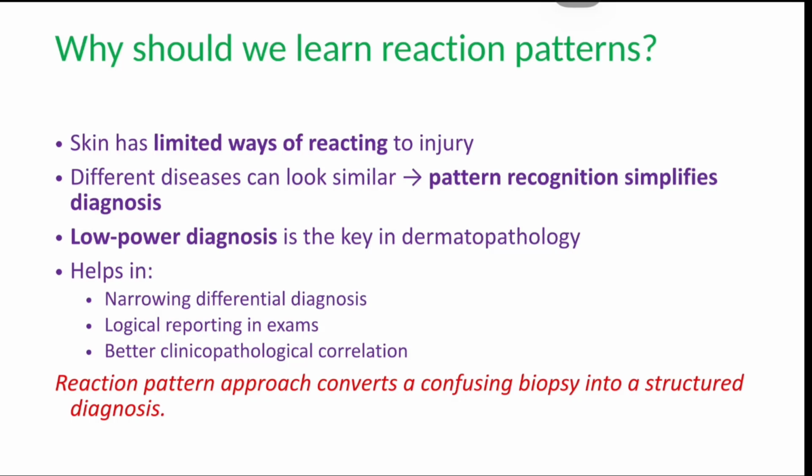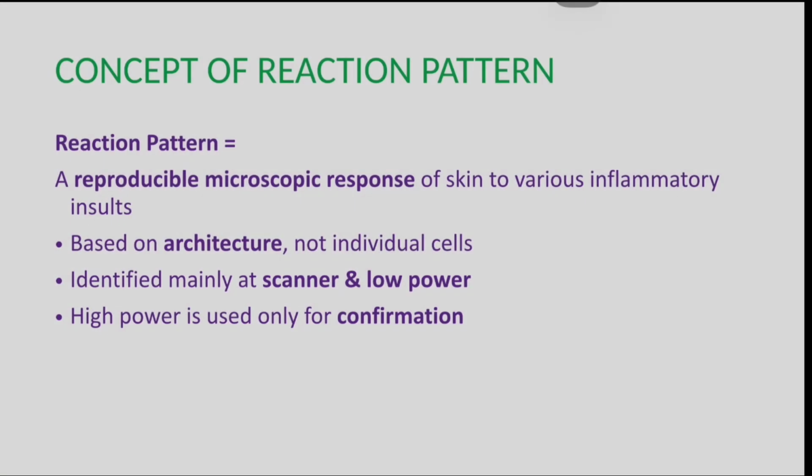And why should we learn reaction pattern? Because skin has limited ways of reacting to injury and different diseases can look similar. So, pattern recognition simplifies diagnosis. As we have already discussed in the last video, low power diagnosis is the key in dermatopathology. So, these reaction patterns help in narrowing differential diagnosis, logical reporting in exams, and better clinico-pathological correlation. So, reaction pattern basically converts a confusing biopsy into a structured diagnosis.